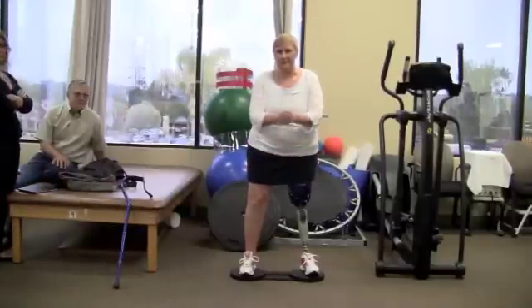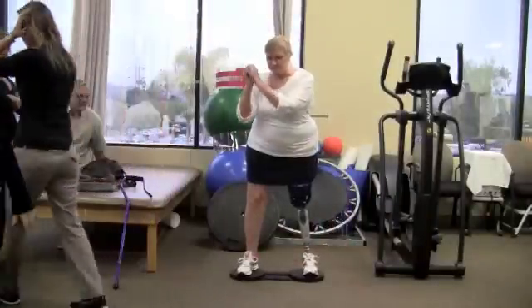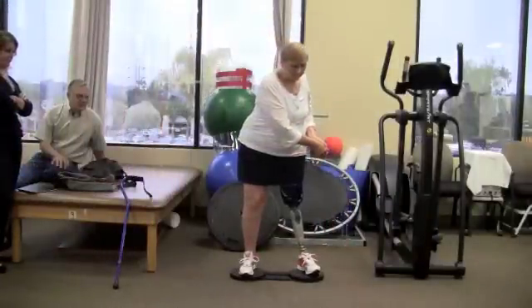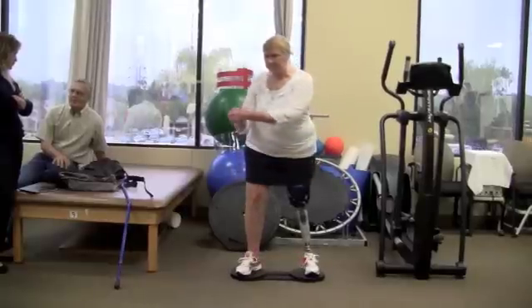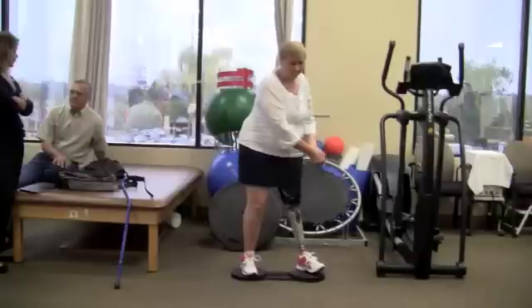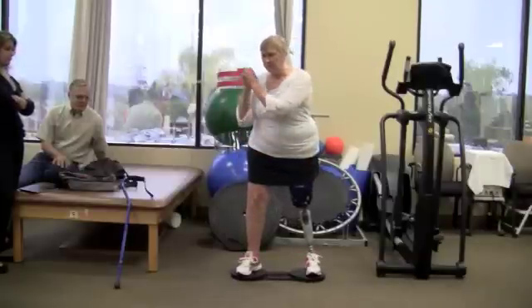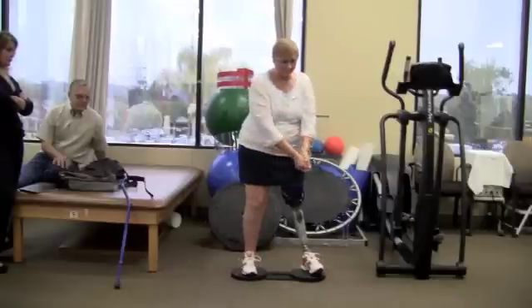Injury recovery is perfect with the 8-board — a zero-impact exercise. Clients that couldn't move up the stairs, clients that couldn't keep their balance when they turn their head, now can. We've used the 8-board with prosthetic leg, total knee replacement, rotator cuff, strength, balance, coordination, and even ADD and ADHD.